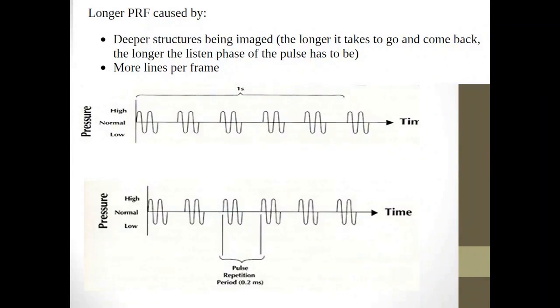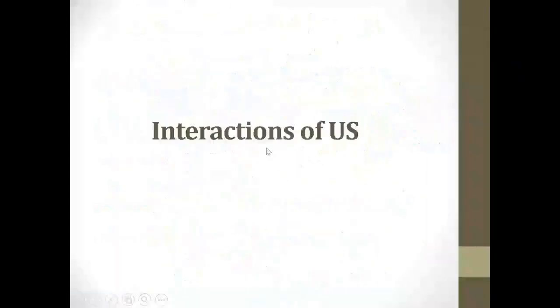You will find that you want to do something called focusing. So what does it do? It starts by taking a group of elements, for example, the first 4 or the first 5. It begins by firing the outermost ones first. Then it starts working on those in between. And after that, it leaves the first one and takes 4 from those it has already taken, and then it takes 1 from the new ones. I mean, let me show you a better picture.